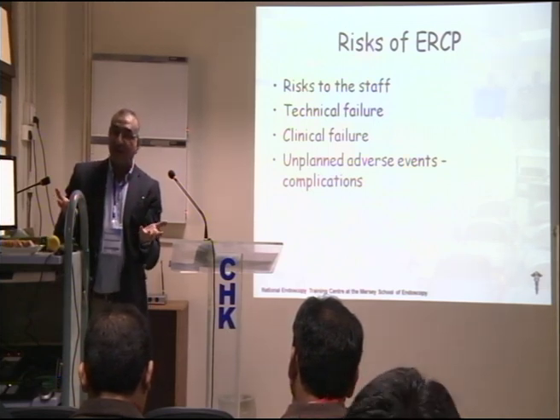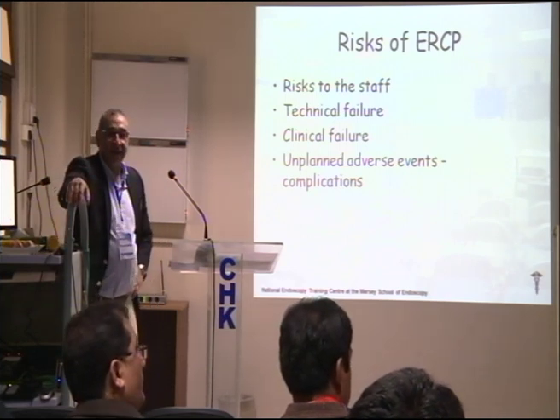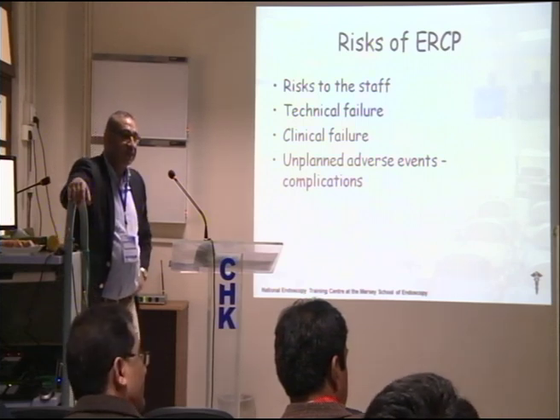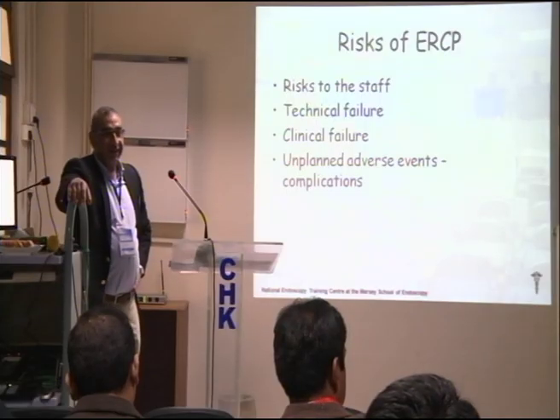Pancreatitis, simple. Okay, for perforation, someone said 1%. Someone said 0.1%. Yes, that point one, that's right. Yeah, that's looking more realistic. 1% is a major issue; you shouldn't be doing it, my dear. That's a 10 times higher problem than what is expected. What about pancreatitis?